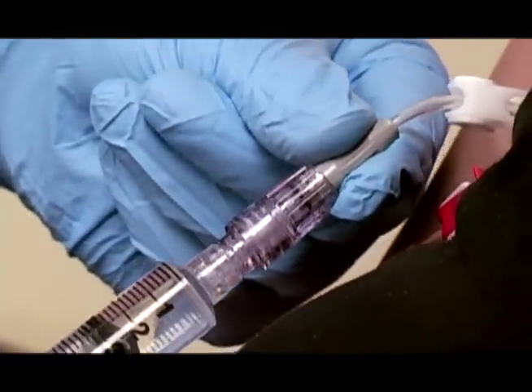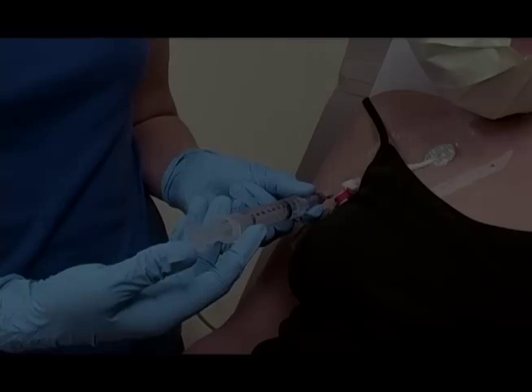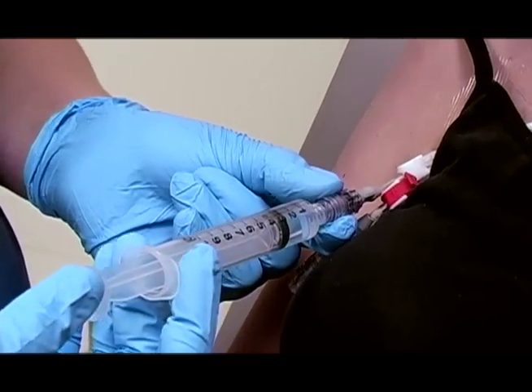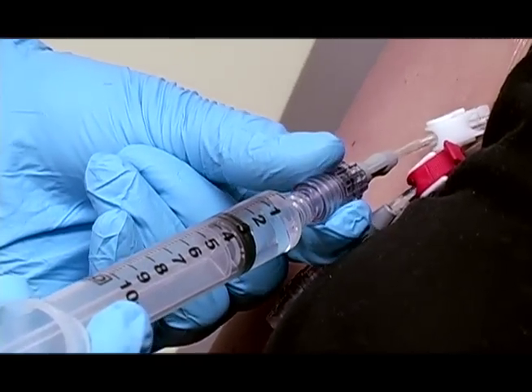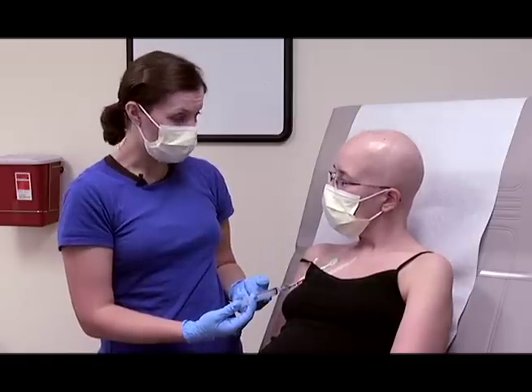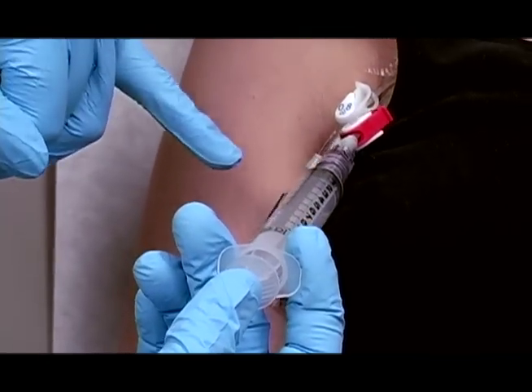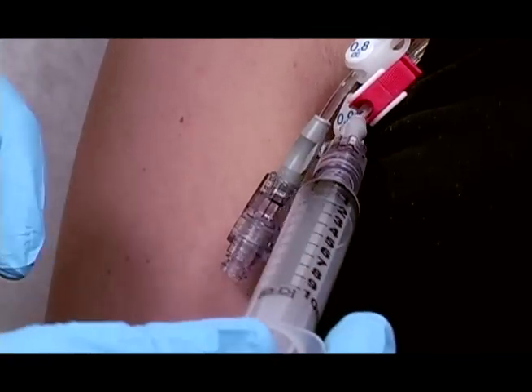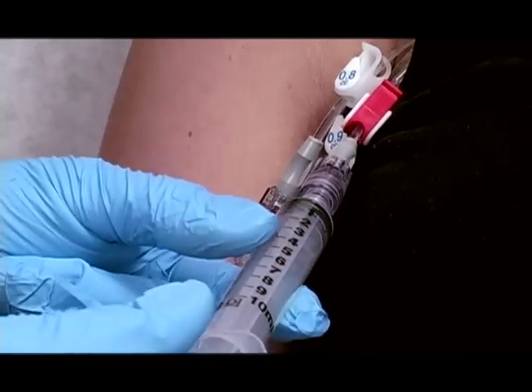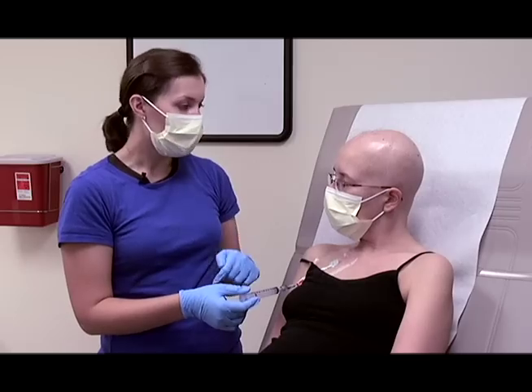Now you will flush the line. If your line has clamps, make sure the line is unclamped. Holding the syringe in your hand, place your thumb on the plunger and slowly push the fluid into the line. If I were meeting resistance at this time and it were not flushing, I would first want to make sure that your clamp is open. If it's open and you're still meeting resistance, don't continue flushing. You'll want to stop where you are, clamp your line, detach the syringe, and you'll call the doctor.